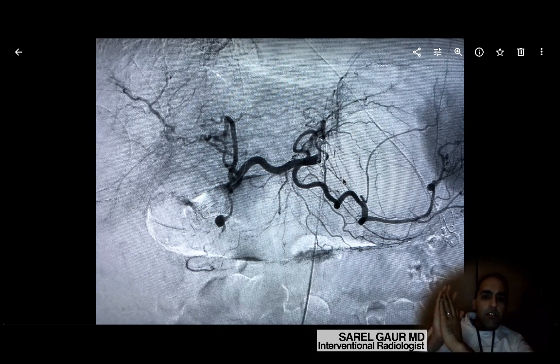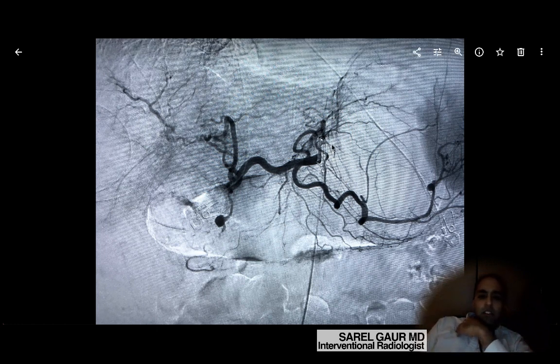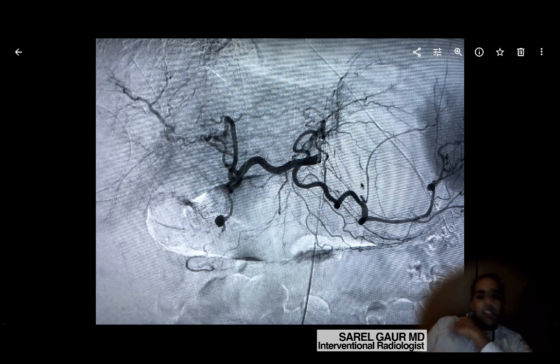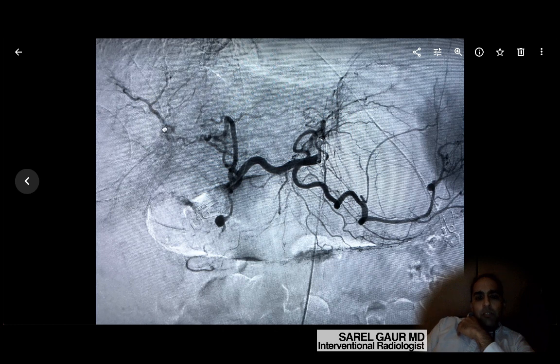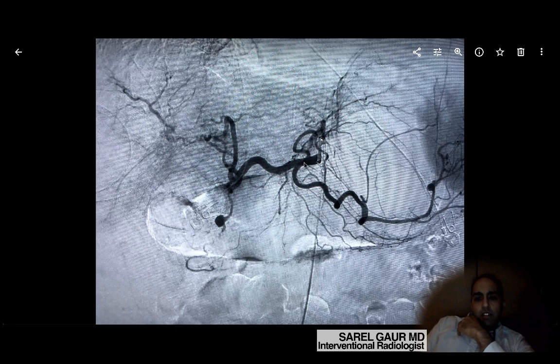We got these images. It looks a little confusing initially, but this is the celiac artery — the first big artery that comes off the aorta as you come from the thorax into the abdomen. What you don't see are the organs these blood vessels are supplying. Out here is actually the liver — if you trace this back, you can see these are the liver arteries, coming back to a common trunk here. The spleen is over here; you can actually see a little bit of it, and this is the vessel coursing out to the spleen — that's the splenic artery.